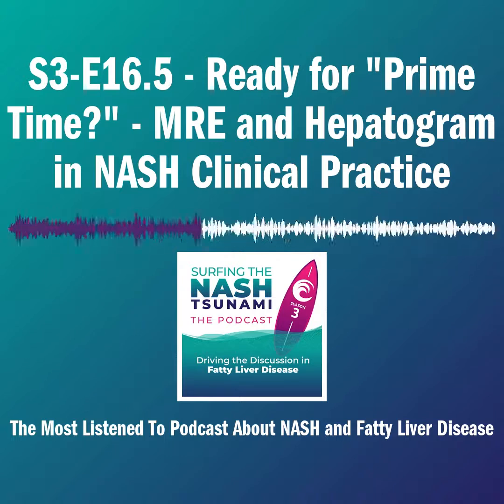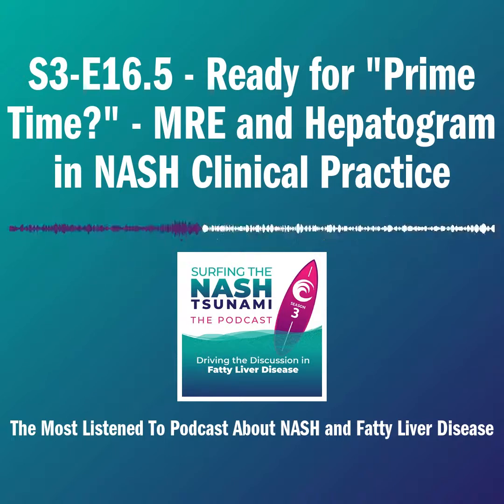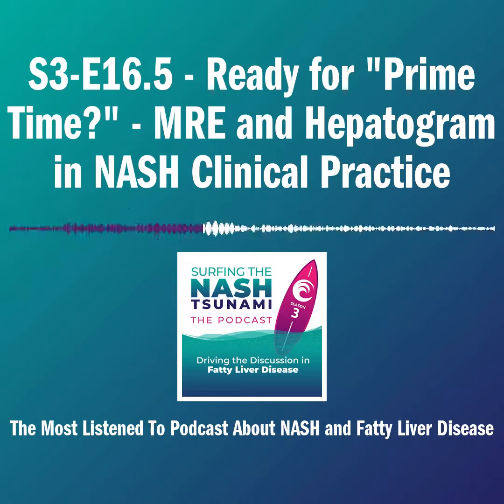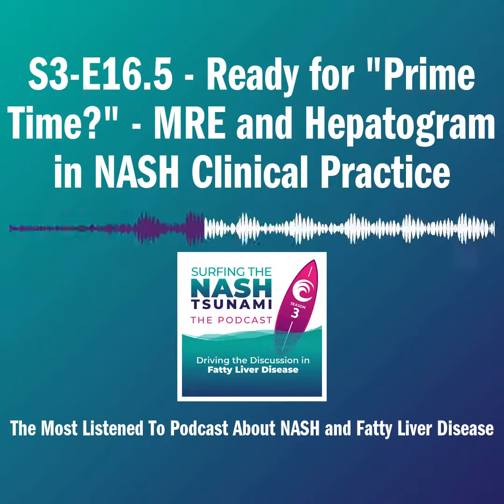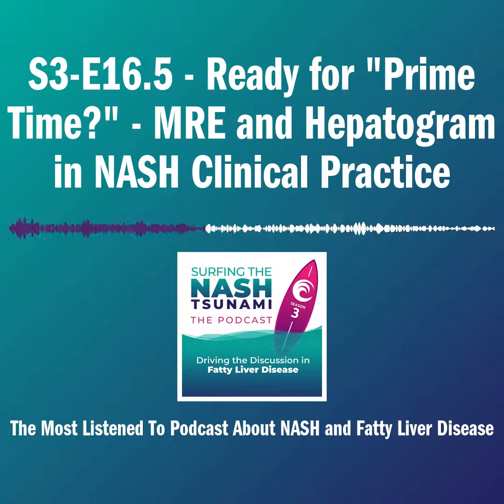And then the last point I'll make is that elastography and PDFF work great at both 1.5 Tesla and 3T, and those are the two main field strengths that are ubiquitous within most modern clinical practices. We do it the same way that Scott's place does it. I made up a name, we call it MREFF to abbreviate it, which means MR Elastography and fat fraction at the same time. So we get both of them done on a lot of patients.